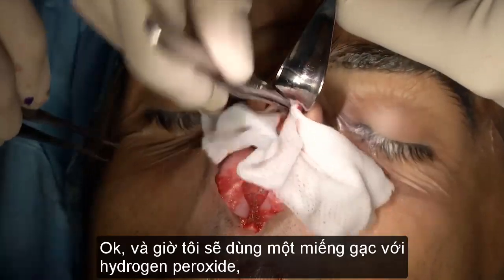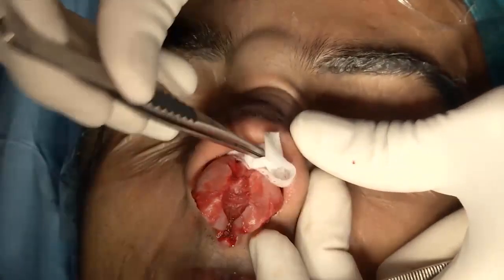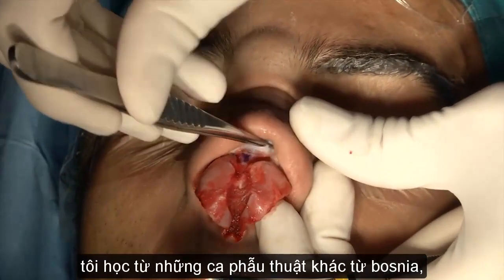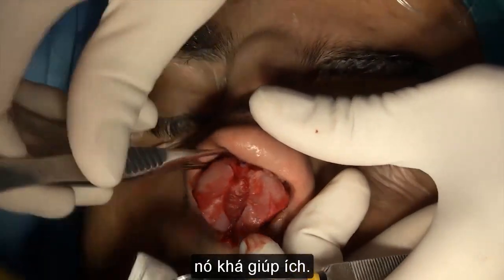All right. So I usually put a little sponge with hydrogen peroxide. I learned this from different surgery, actually in Bosnia, so it works pretty well.